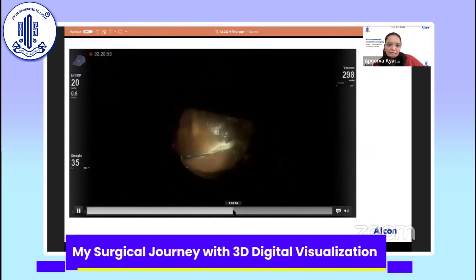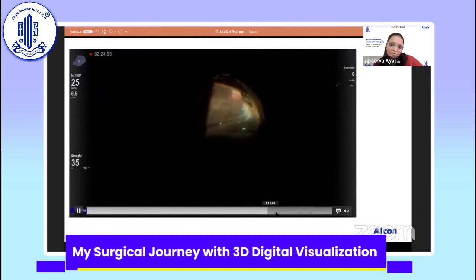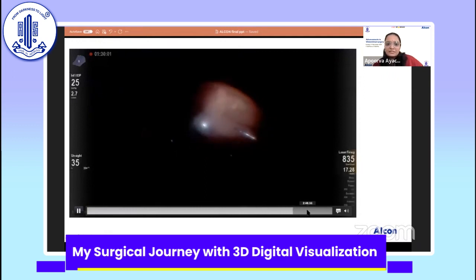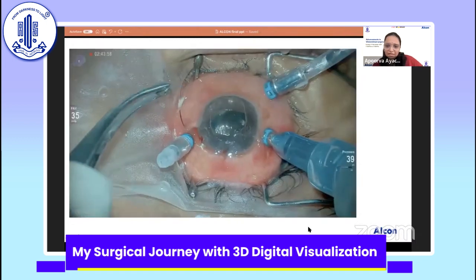And then the PFCL went subretinal, so I removed that, and then refilled the PFCL, attached the retina, smoothened all the wrinkles, and did some more retinectomy and attached the retina finally. And this patient is doing okay with this kind of island of retina.